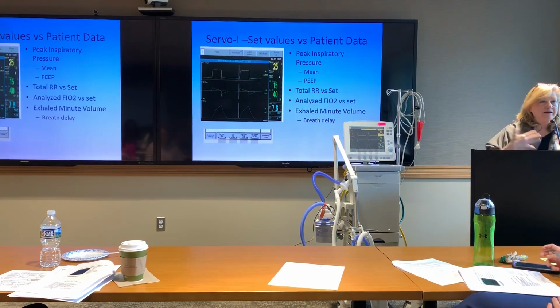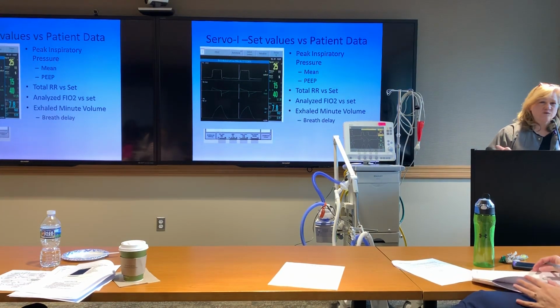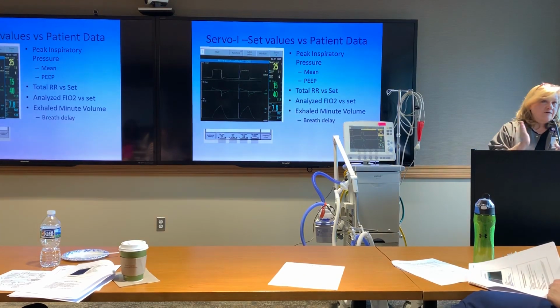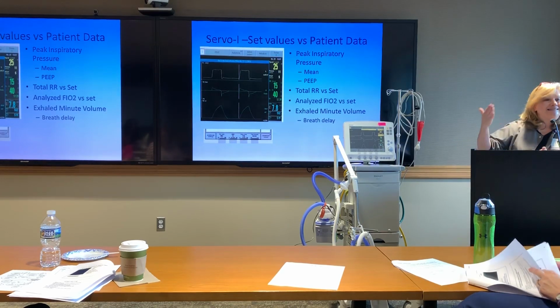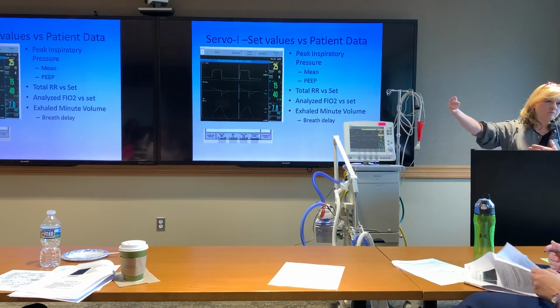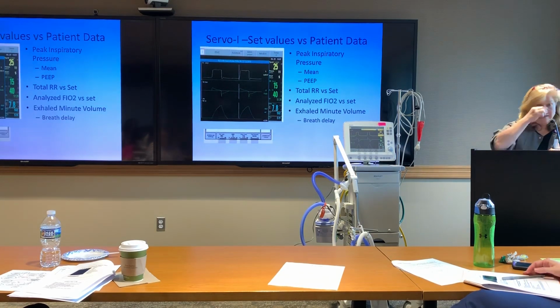But with tidal volumes now, we know it's very dangerous to do anything more than 8. There was a study that came out, I think, at the end of 2017 that said for every milliliter per kilo of predicted body weight greater than 6, you're actually increasing the likelihood of death. So we still use 8 as a default because people get air hungry on 8 as it is.